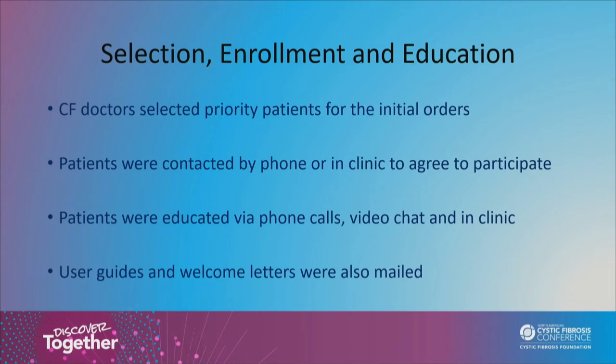Then on the exact opposite end of the scale for some doctors were patients that reported a lot of symptoms, called often with sick calls, had more advanced lung disease. So it does sound like all the patients that might be in a typical CF center. So that was way more than the first amount of spirometers that we had.